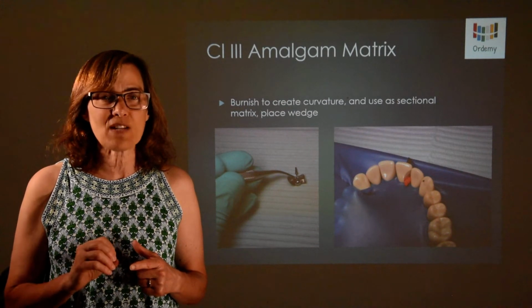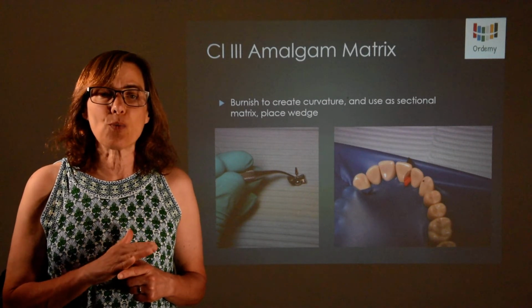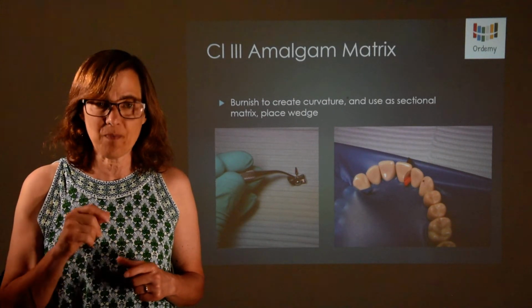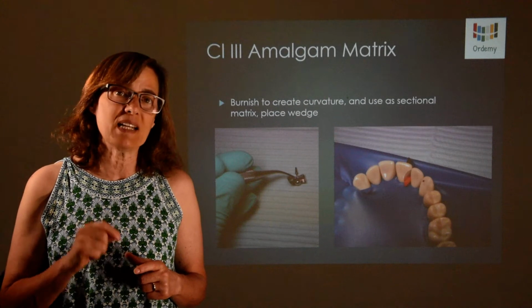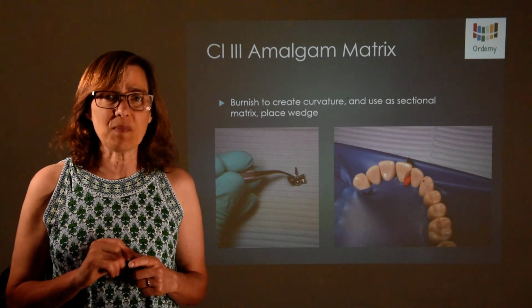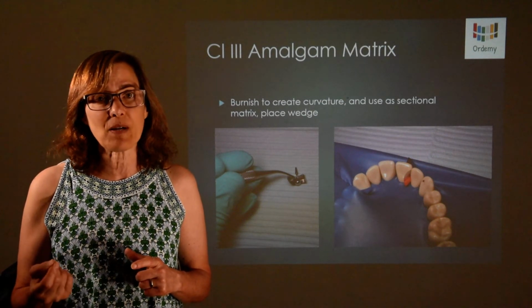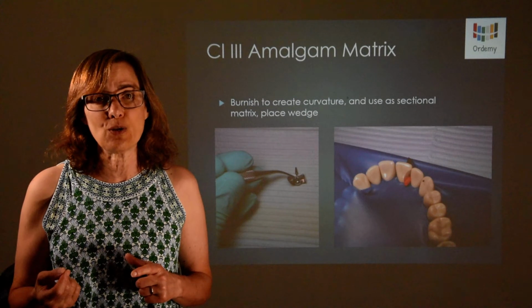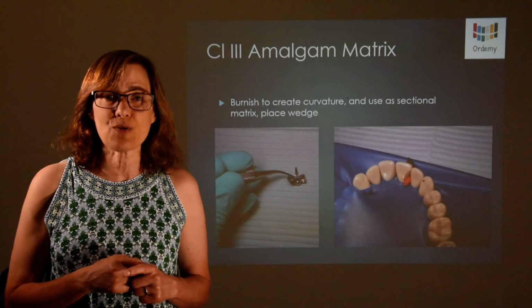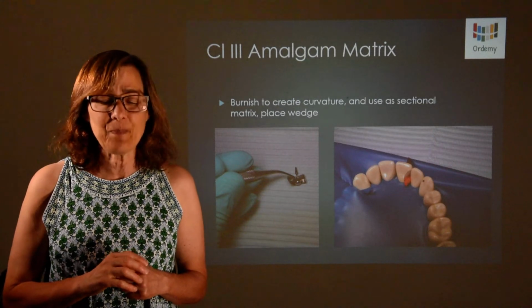Normally it only leaves scratch marks, and it does not carve well. It's best that you have finished carving it before it starts its final set, and that is at the 3-4 minute mark. Depending on the amalgam, some are faster setting than others. That is something that you need to check with the doctors that you work with.